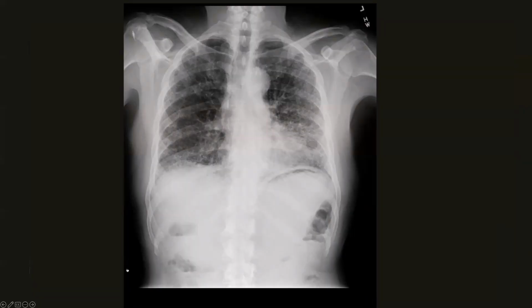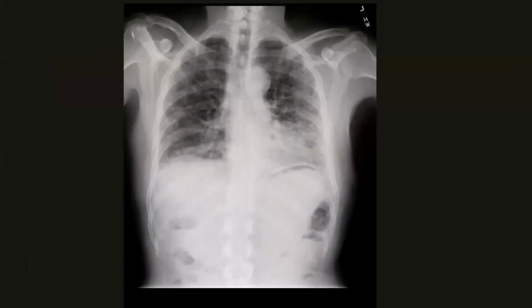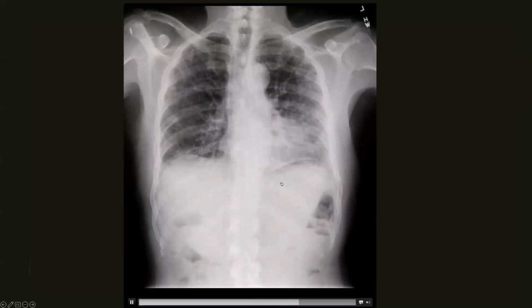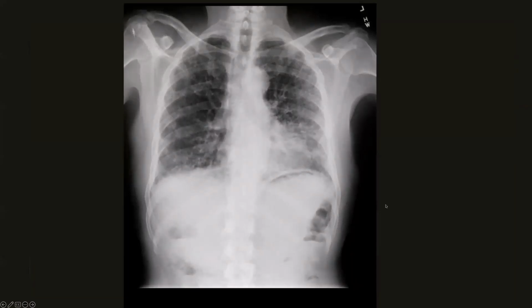This is his preoperative DDR examination. And again, this is a patient that shows some weakness of the diaphragms, likely due to the underlying fibrotic lung disease. There is asymmetrically decreased excursion of the left hemidiaphragm, but both diaphragms are moving fairly well. So no evidence of paralysis here.